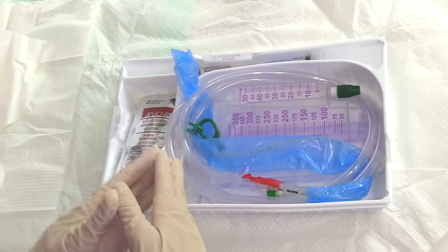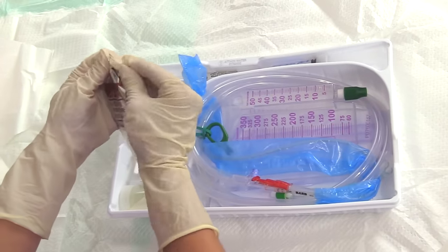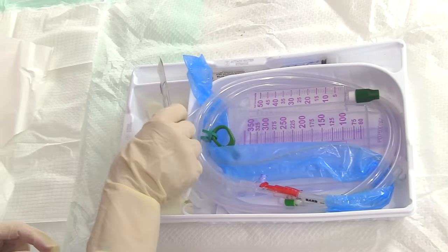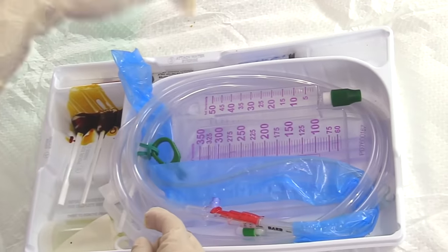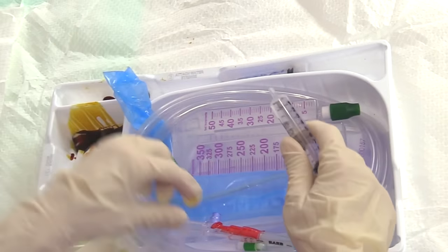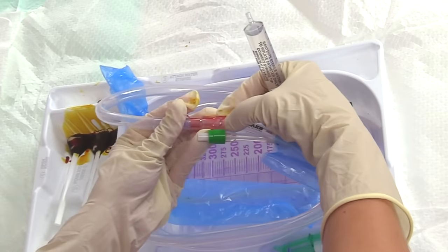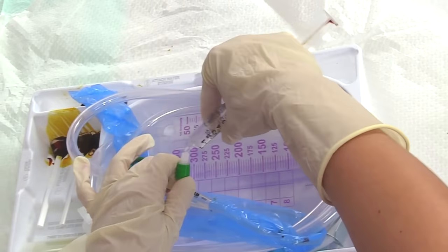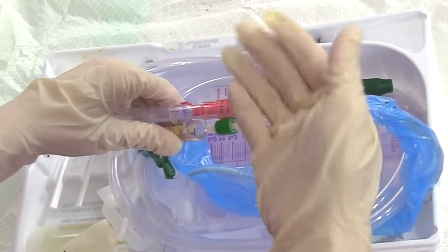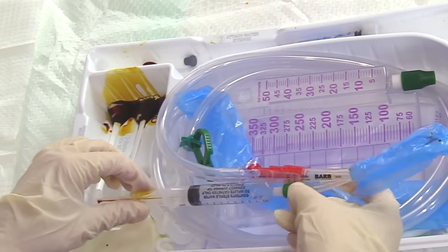Now I'm ready to prep the inside contents of the kit. First, I'll open the iodine and pour it onto my swabs. Then I'll attach the water syringe to the Foley — check the label to see how much water to put in and what size the catheter is; it's a 14 French, so keep that in mind for documentation. I'm going to insert this into the port but will not check the balloon, because doing so could change the shape of the balloon and cause tears within the urethra.